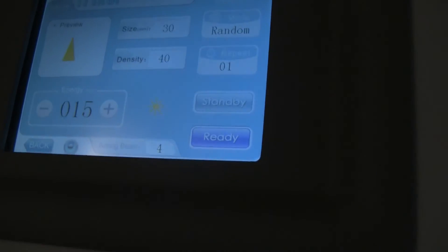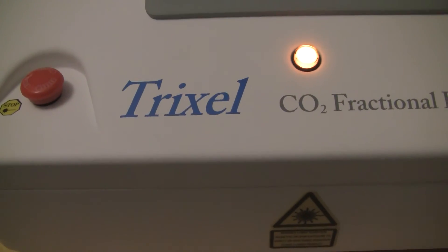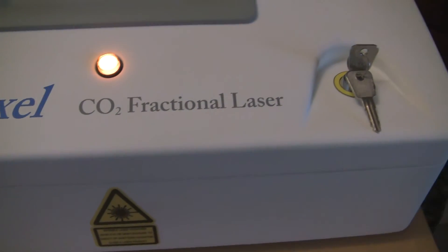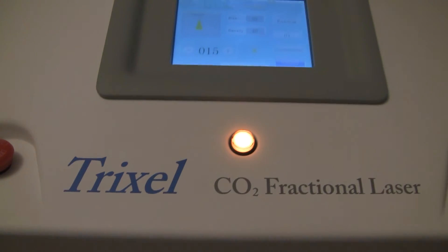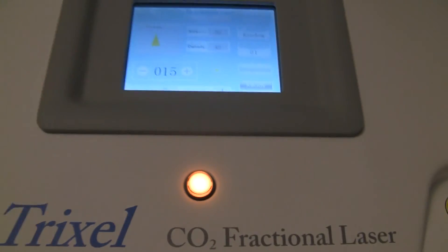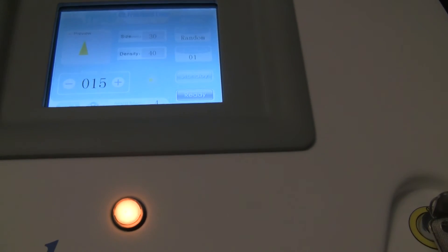This particular unit is a Trixel — it's by Syntech. It's a great fractional resurfacing laser.